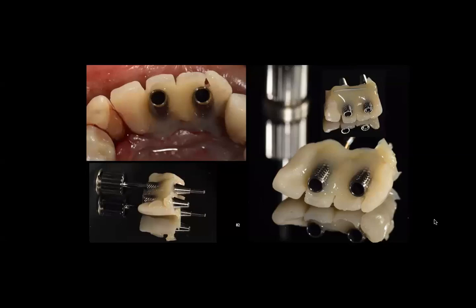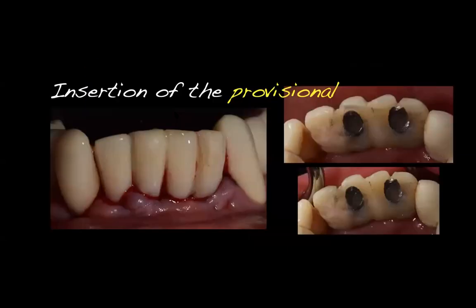I picked up a paper clip and I just put a paper clip back there. Or if you have something else, such as an ortho wire, you can use that. But I basically reline it in the patient's mouth. You can see the abutment. I didn't even make an adjustment to the abutment. And then I'll take it off, obviously, and I work outside the patient's mouth, and then I put it in. And here is the patient with a provisional in, okay? She was happy. She didn't want to have anything removed, okay?